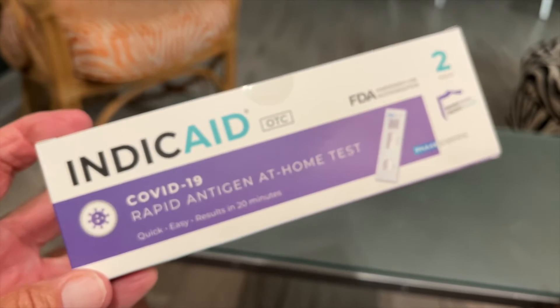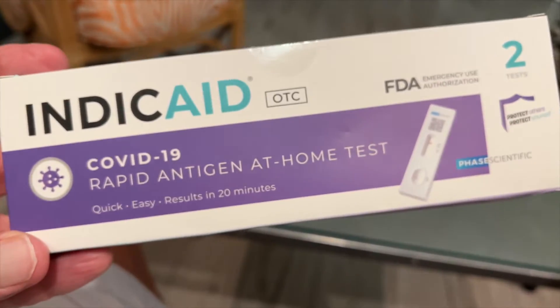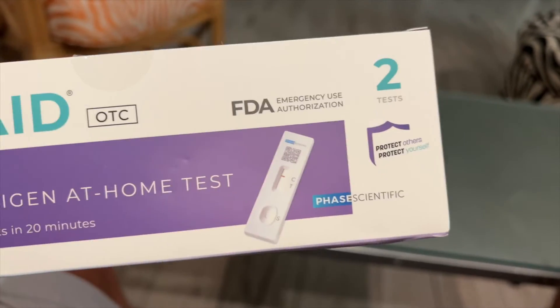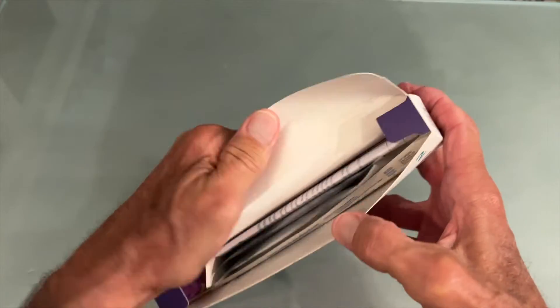When I was on the plane, everybody and his brother was hacking and coughing — it was a nightmare. FDA approved. Let's check it out, let's open the box and see what's inside.